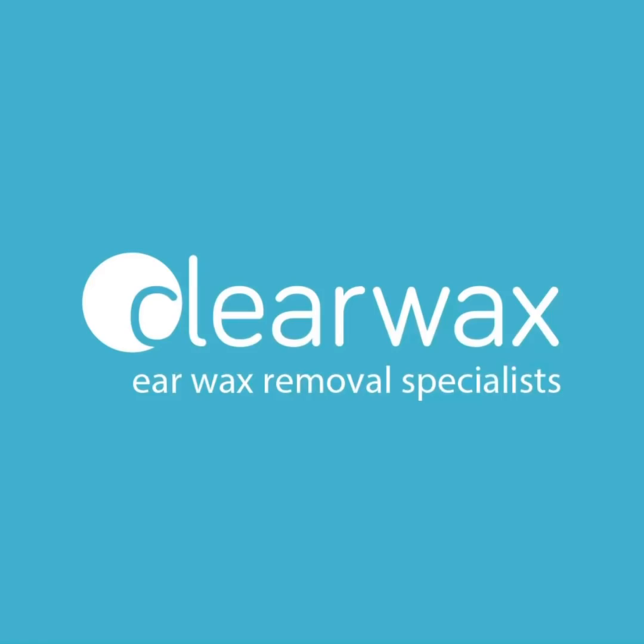Someone made a comment about the focus and clarity of a previous video and wondered whether it was the hairs causing that. The video was not out of focus — it's just that when you've got a narrow ear canal the wax is quite lateral and you've got hairs there, so naturally you won't get the clearest image. It's not preventing me from removing the wax, but there are certain cases where there's so much hair that it's very difficult to see and I do have to use forceps to pluck some of those hairs.